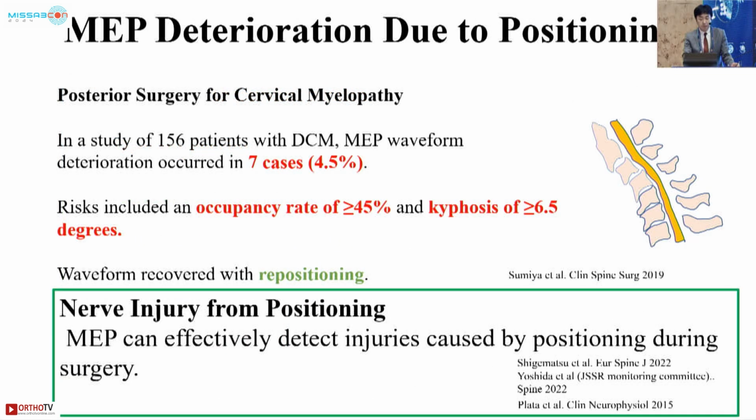Here, positioning also plays a significant role in MEP deterioration. During surgery, it's critical to monitor for nerve injury resulting from excessive flexion or extension during cervical procedures.